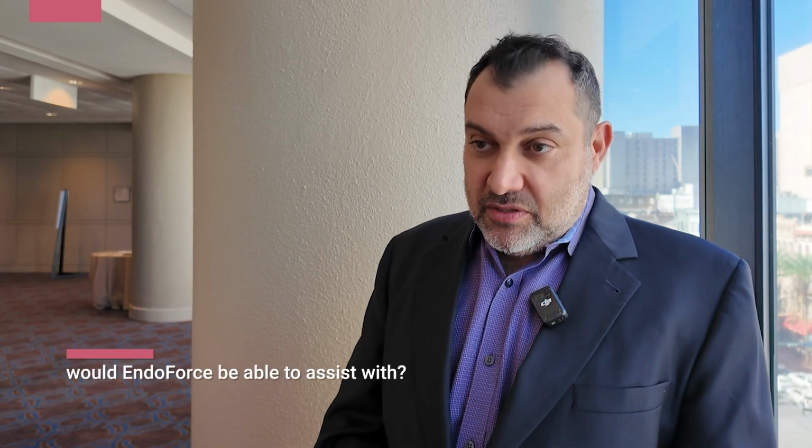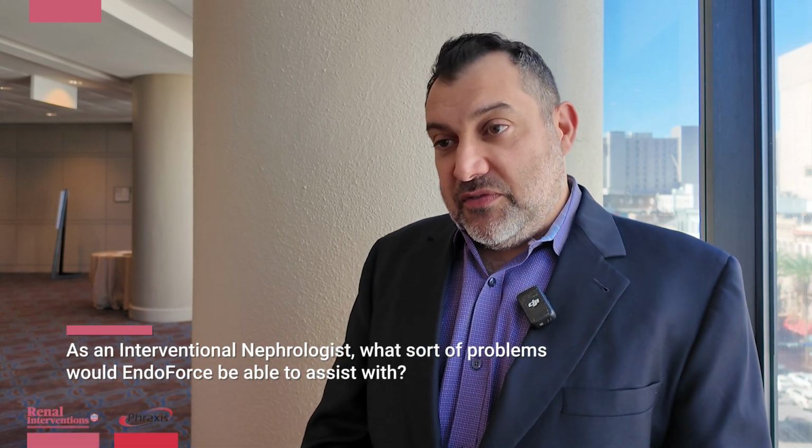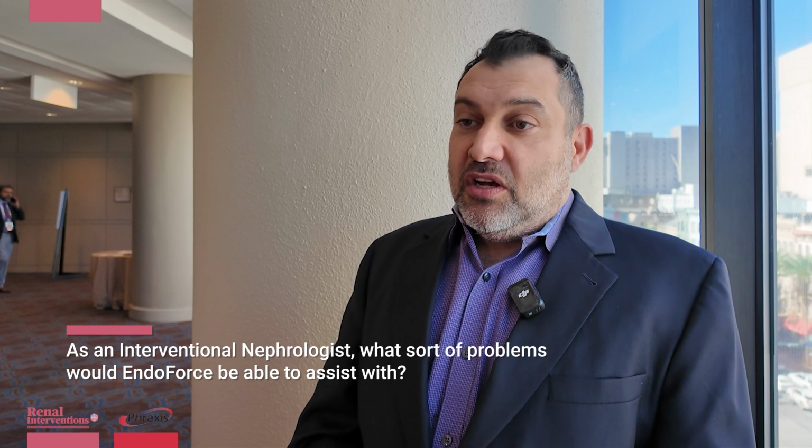So in the world of ESRD and vascular access, we have a difficult situation. We only have three options for folks to get dialysis. Those are catheters, grafts, and fistulas, and each of those comes with a problem. Catheters, of course, have a high infection rate. Fistulas, many of them don't mature, and they take a long time to mature. In the cases where they do, up to 50% in the US.